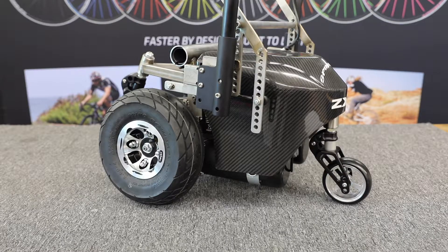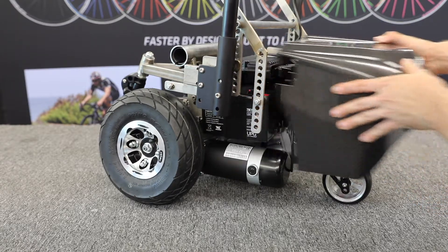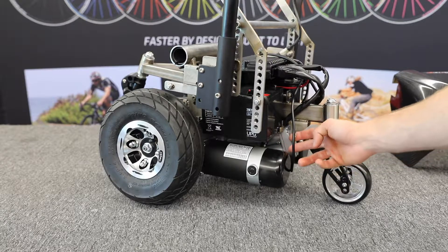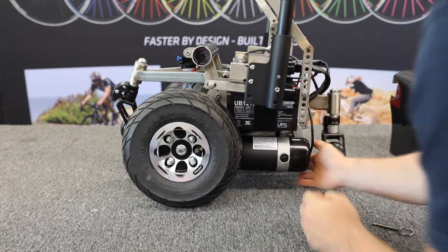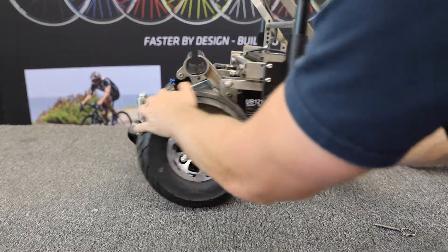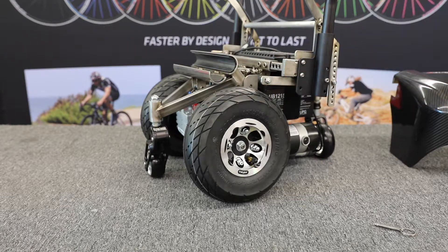If disconnecting from the ZX-1 is the only option you would be interested in performing, then please listen to the following steps. With the assistance of another individual, please first remove the rear carbon fiber cover. Next, you will see this hitch pin right here that connects the frame to the actuator. You are going to remove that hitch pin which will disengage the actuator. Once I release the actuator from its housing in the back there, the front clamp then loosens up and releases, thereby allowing the user to exit the ZX-1 while having no battery power.